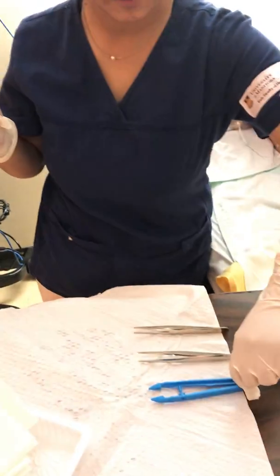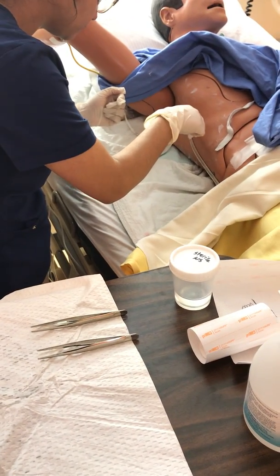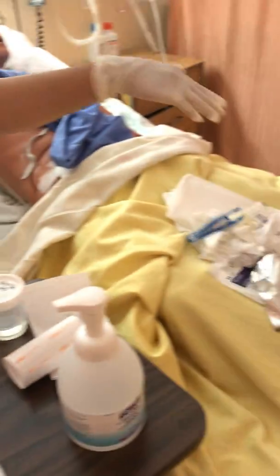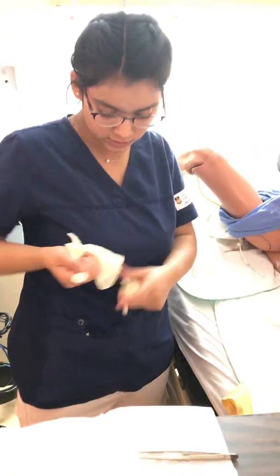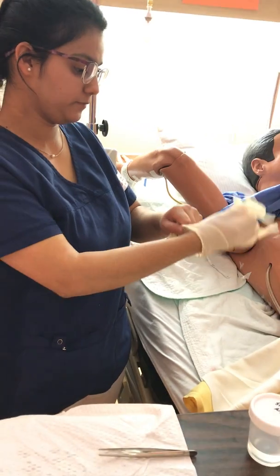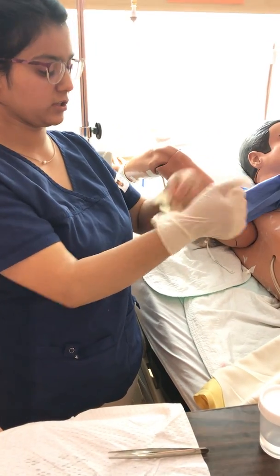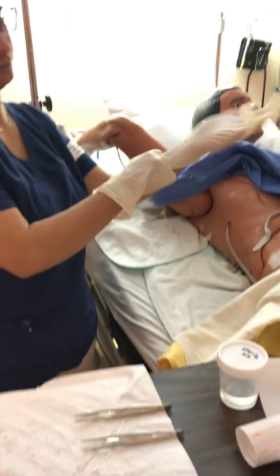So now I'm going to take my blue forceps, and we're going to take this jello net out. I'm going to wrap that around. And now this is all garbage, these gloves are all garbage. I'm going to do hand hygiene, and I'm going to put on new gloves. Occlusive. And we're going to clean our site by cleaning it with normal saline.